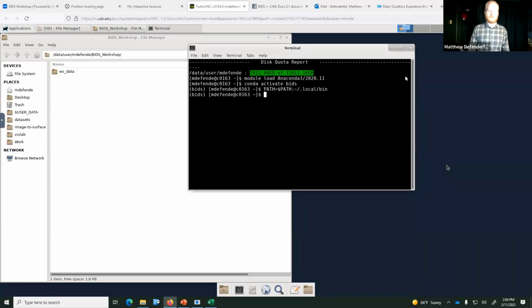all at once. But if you have behavioral data or text data or things like that, just spreadsheet data associated with those scans, you can convert those at any point because those are not actually being converted by this tool. That's what I would say.